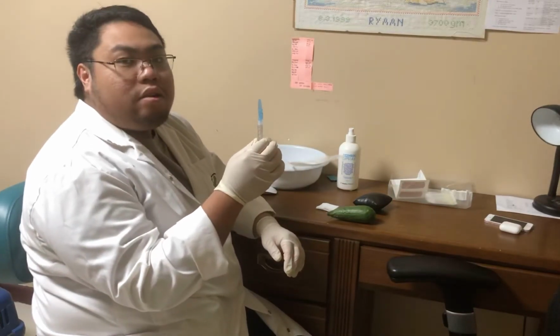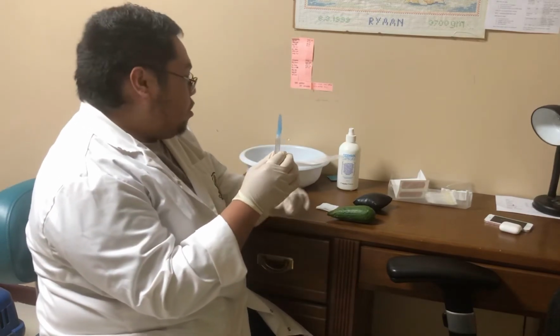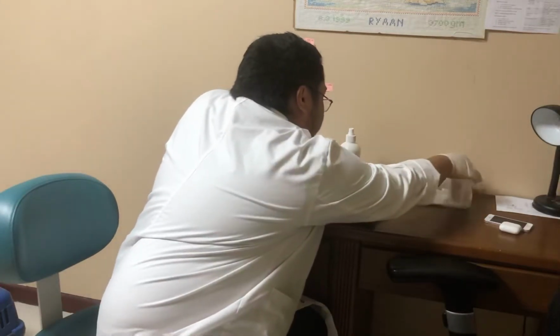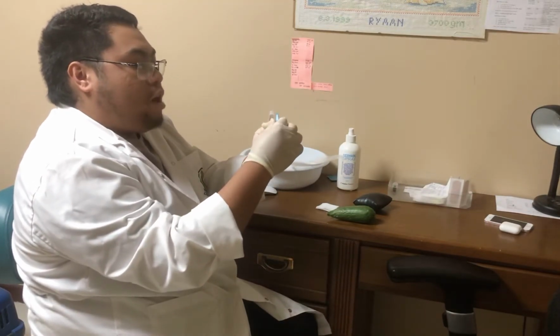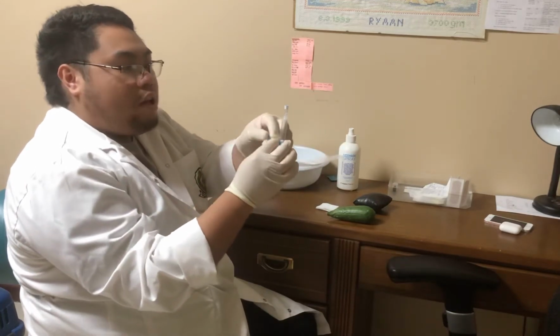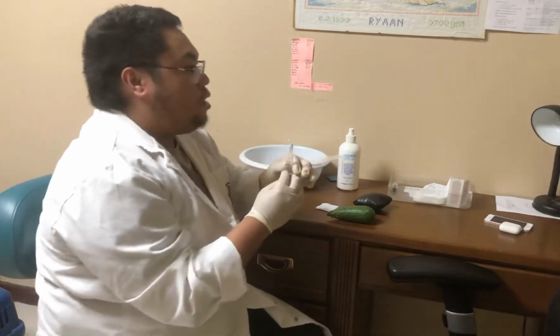After this, seal the needle immediately with the cap or the bottle cap. For this one, we have a bottle cap. So basically, we're going to be doing this and throwing the needle in the disposal area.